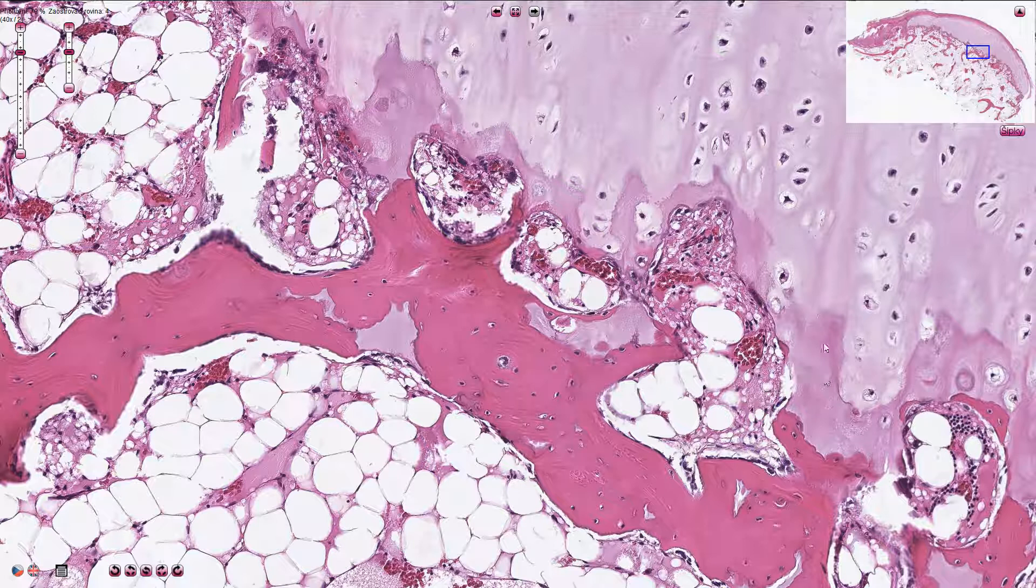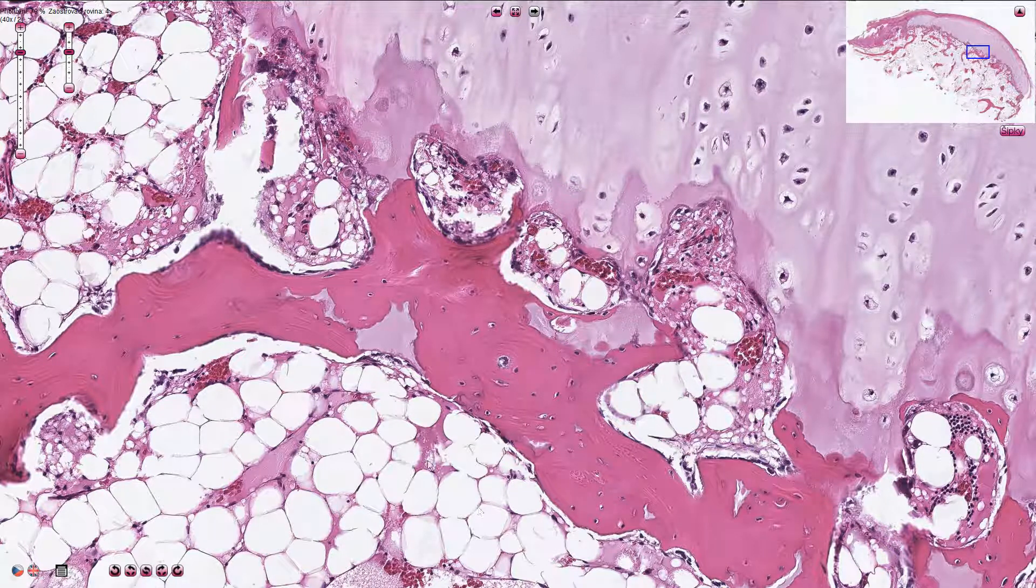This is the area of partial mineralization, and here we have the dense eosinophilic ossification. Around the bone trabeculae we have normal adipose tissue.